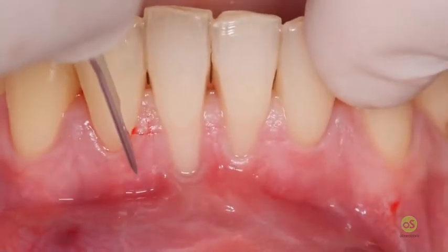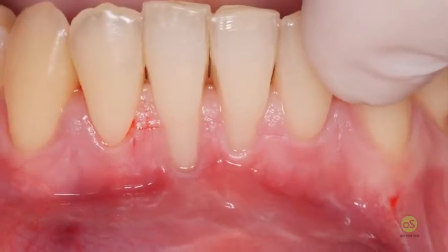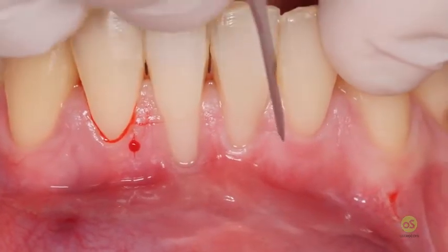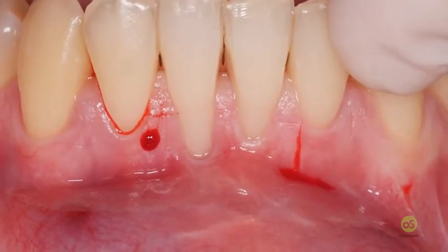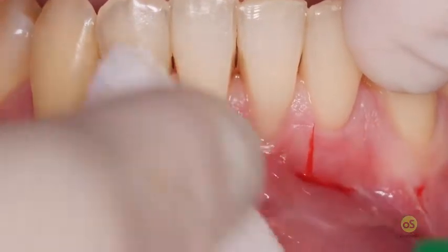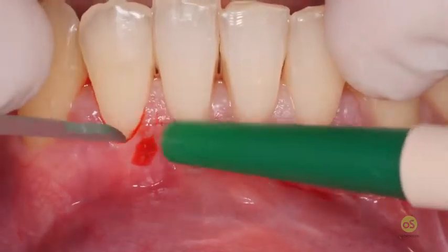Then the true vertical release incision should be very limited in apical direction at the beginning. We don't want to get the alveolar mucosa at the beginning, because I want to see much better.